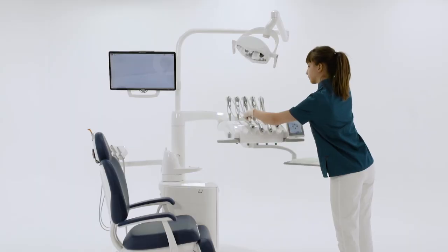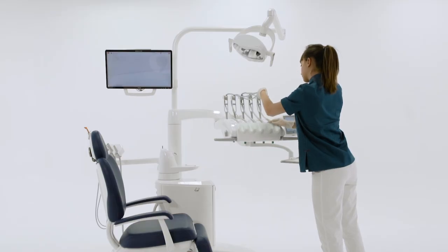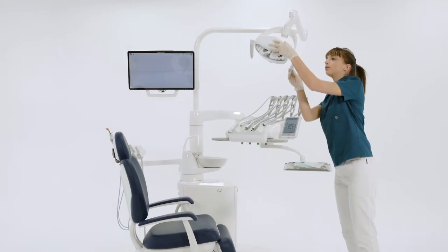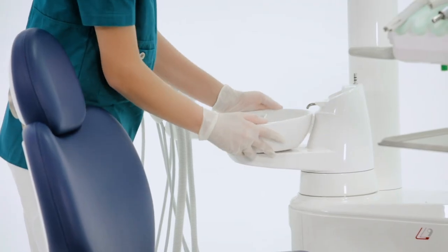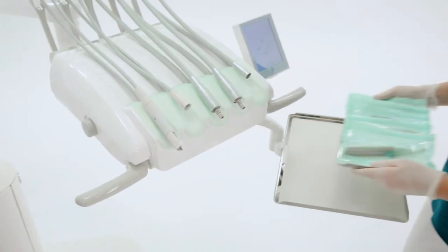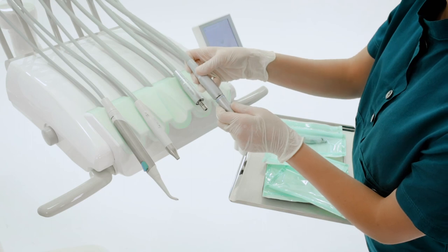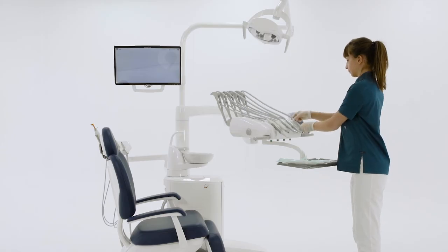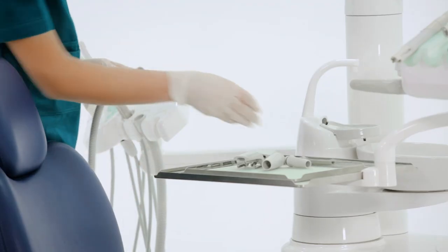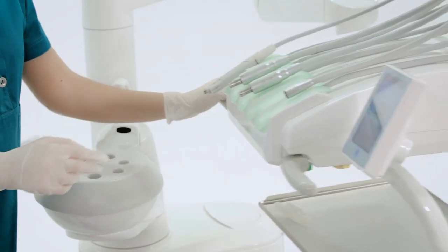To complete the tasks at the start of the day, the assistant puts back the sterilized and disinfected items and applies the required disposable covers. Before treating the first patient, a flushing cycle is performed.